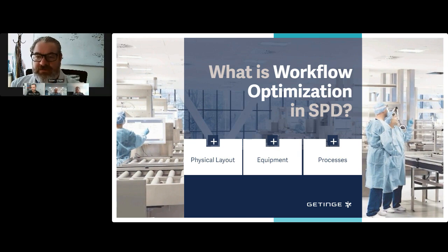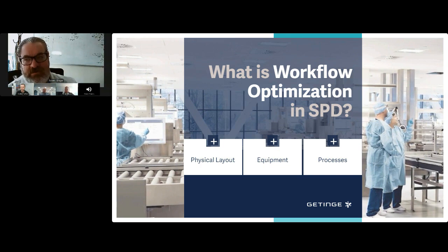And that the activities are clear. The connections between those activities are unambiguous, and that we develop workflows that move the process forward with as little waste as possible. So some of the ways we can do that: standard operating procedures, visual workplace, making sure those connections are clear, that we have feedback loops, and when something is sent, that we're also providing that information. And then, lastly, and I think this links back to both physical layout and equipment, is making sure we have clear visibility and a physical layout that has adjacencies that make sense.